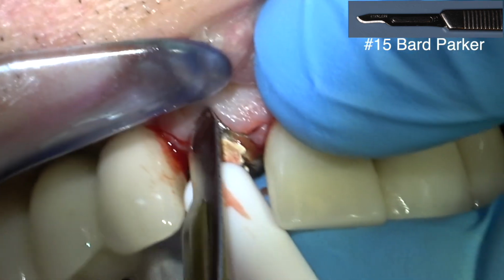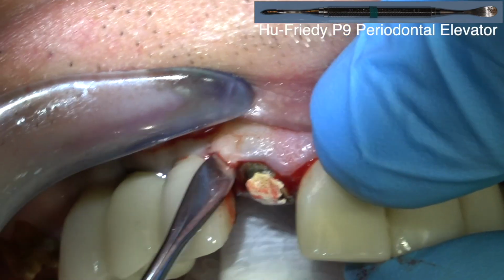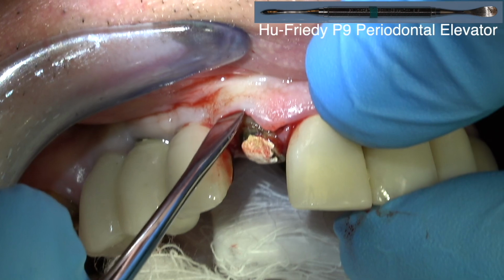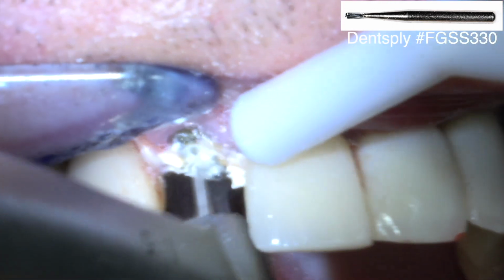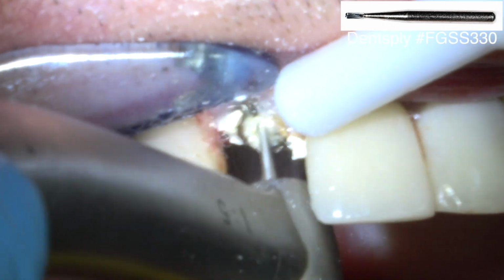Just makes it easy if you've got a little movement to extract it with the Easy Extract. So now, why am I reflecting this flap? I want to see the alveolar crest, because when I place the implant, I want the coronal part of the implant to be at the alveolar crest. So you can see there's the alveolar crest.